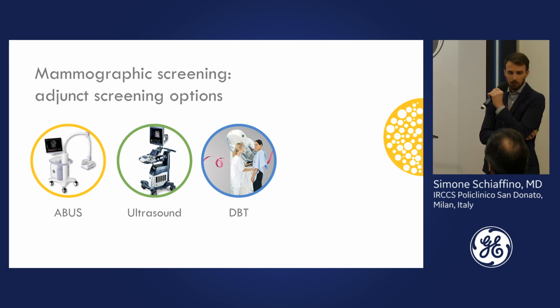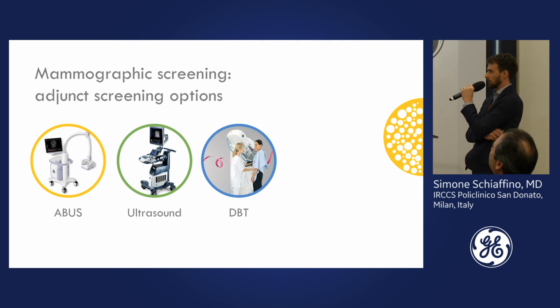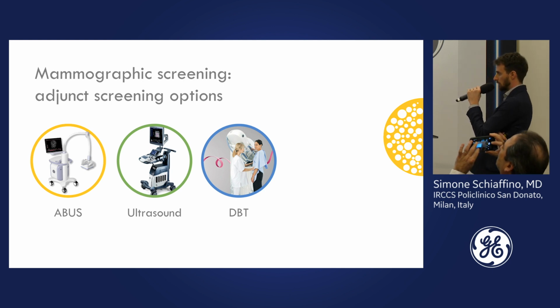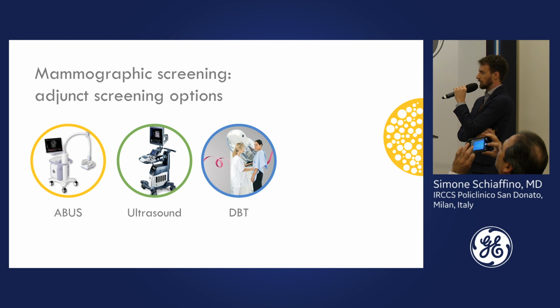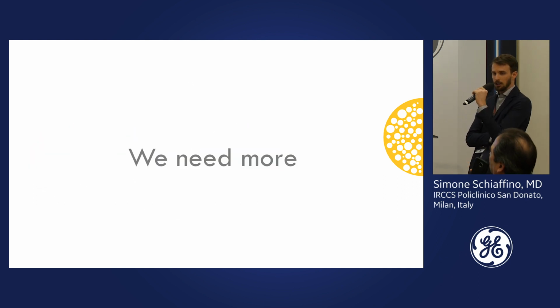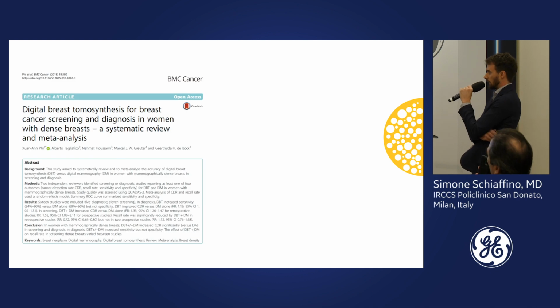So we need more for these women. And talking about literature, this is a recent meta-analysis published by Dr. Fee and Dr. Tagliafico. They aimed to systematically review and meta-analyze the accuracy of digital breast tomosynthesis versus digital mammography in this kind of women. And they found a significantly higher cancer detection rate in the screening and in diagnosis for breast tomosynthesis.